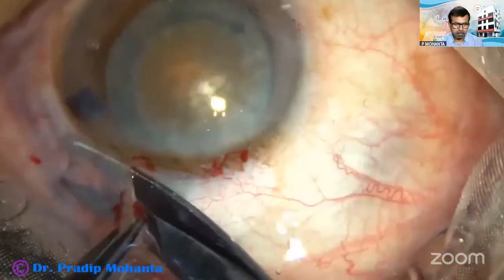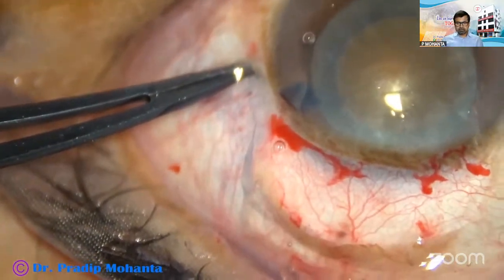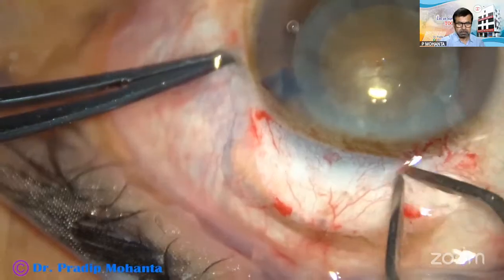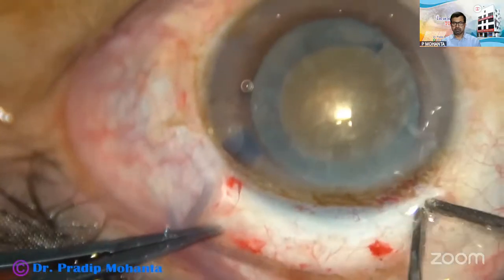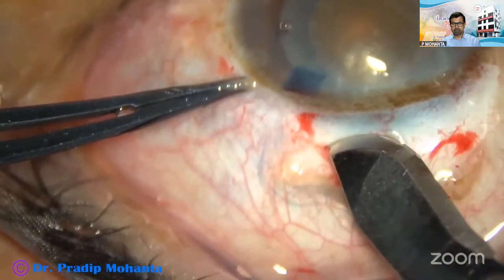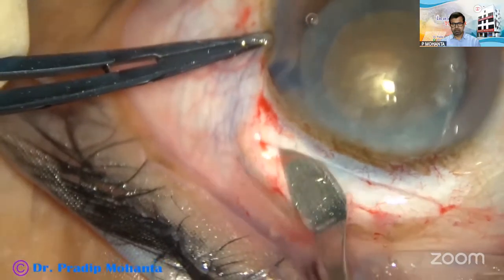Since this is a hard cataract, the tunnel length should be at least 7 mm. Mild cautery is done. We may not do cautery. In those cases, the assistant has to pour in the saline or ringer lactate. The tunnel is made, incision placed, a crescent blade is used to make the tunnel.